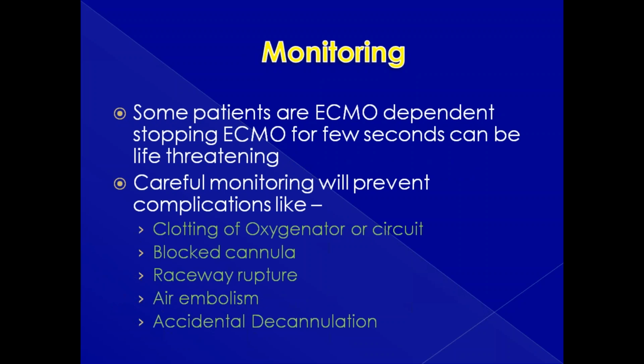Some patients on ECMO are dependent on it, and cannot tolerate stopping ECMO even for a few seconds. So careful monitoring will prevent complications like clotting of the oxygenator or circuit, blocked cannulae, raceway rupture, air embolism, and accidental decannulation. Be very, very mindful about accidental decannulation.